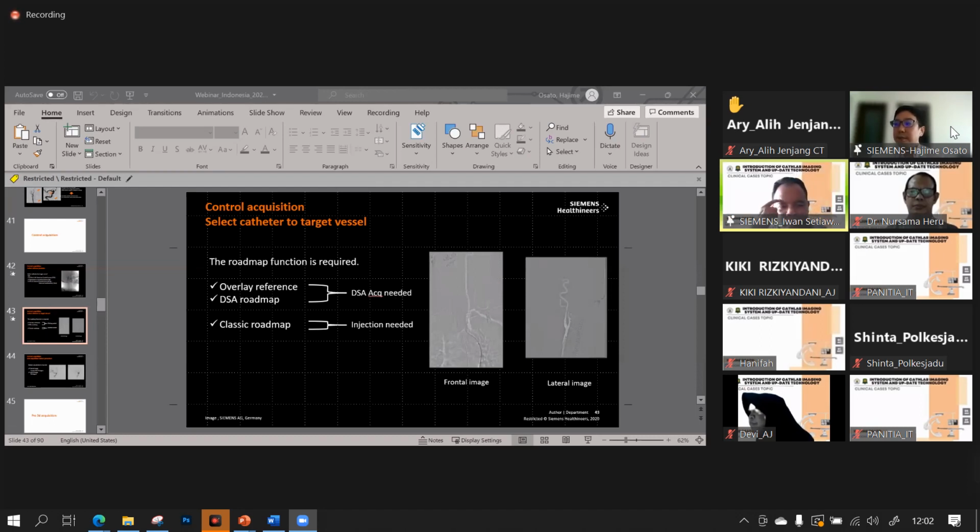Jadi teman-teman, kita tadi melihat ada 3D akuisisi. Nah, ini ada pertanyaan bagaimana kita mengurangi motion artifact, sementara di CT scan saja diciptakan CT 64, CT 128 yang scan-nya lebih cepat untuk mengurangi motion artifact. Nah, Mr. Hazime menjelaskan bahwa di Cathlab untuk melakukan Dyna CT, mendapatkan gambaran 3D, dibutuhkan waktu 5 detik, yakni si arm-nya berputar mengelilingi tubuh. Di samping itu ada beberapa aplikasi untuk mengurangi motion artifact, baik pada gambar natif ataupun gambar DSA. Jadi seperti itu kurang lebih penjelasannya.